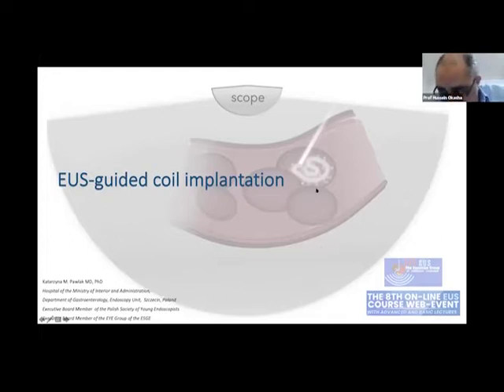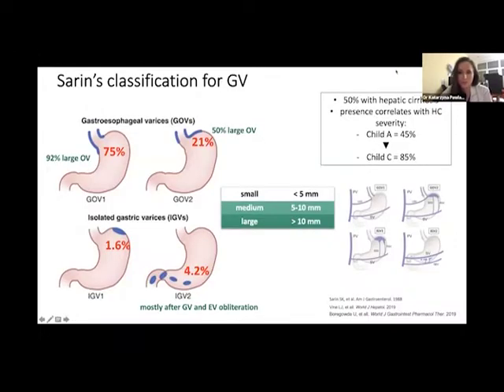Okay. Thank you so much, dear professor, for the introduction, and it's a great pleasure and honor for me to be here today and to have this possibility to present a short case and the management of gastric varices when it comes to EUS-guided coil implantation. Firstly, I would like to say a couple of words about the pathology and what we should know before we start to perform EUS-guided coil embolization.